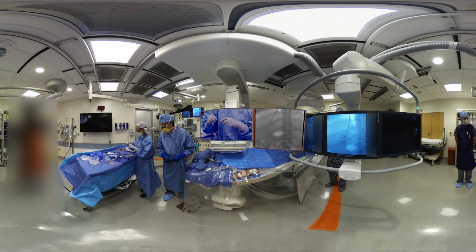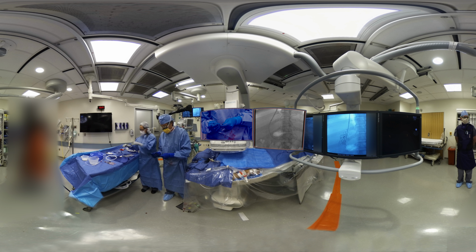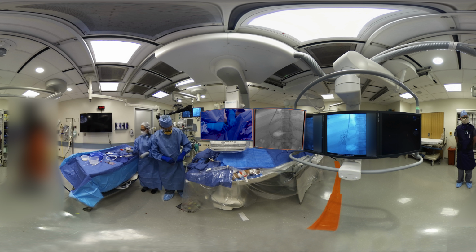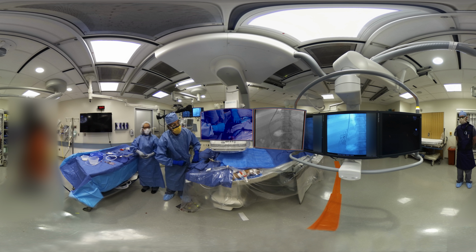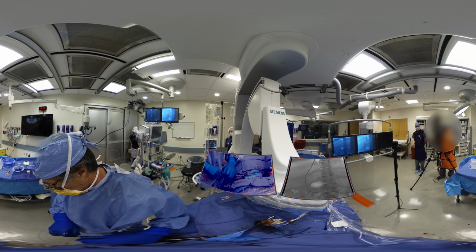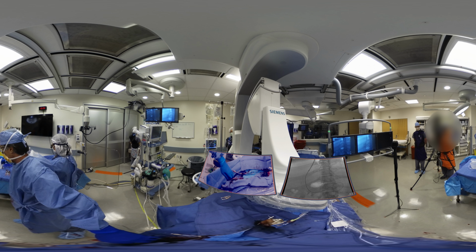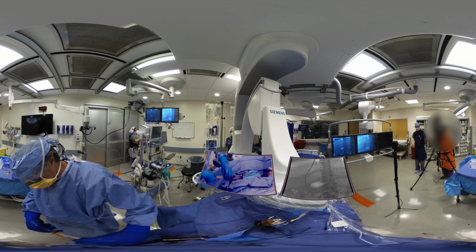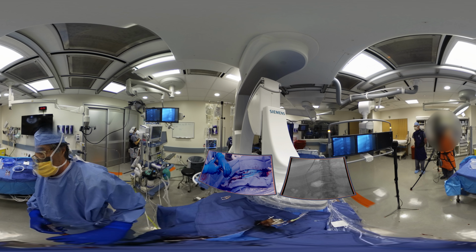Wire. Wire. I'm going to advance quickly, a little bit of tension, a little more. Great. And you know, since we got the balloon down, I'm going to do something slightly differently. We'll do our portal vein entry run here, our initial splenic venogram, and then we'll just back it up and dilate. But I'm comfortable now because I know that we're going to be able to get all our equipment into place and get that sheath down.